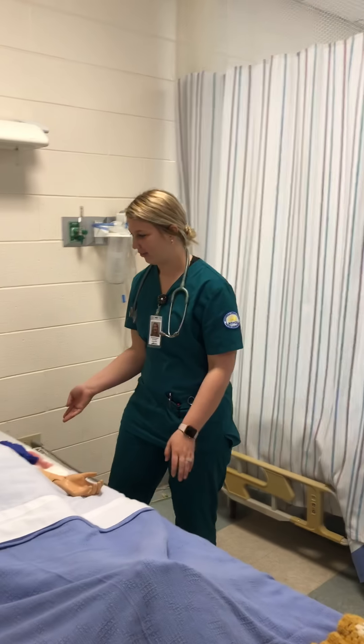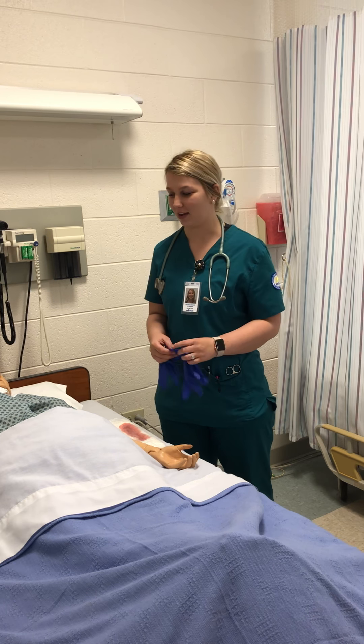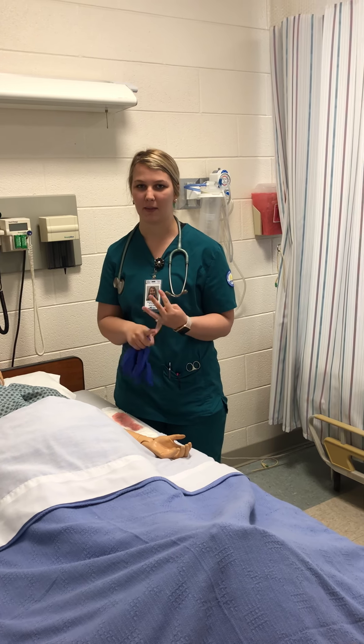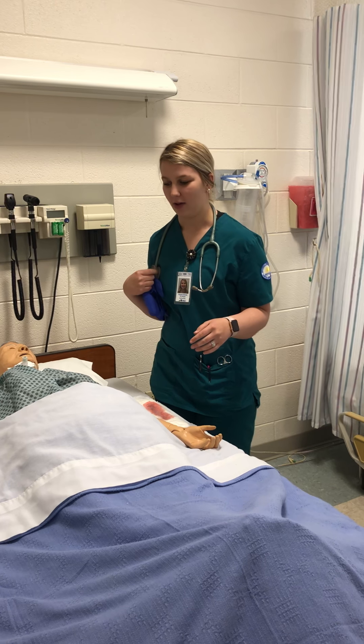So I have my new mother here and I'm going to take her vital signs. I'm going to check her blood pressure, pulse, respirations, temperature, oxygen, and her pain. She's not in any pain right now.